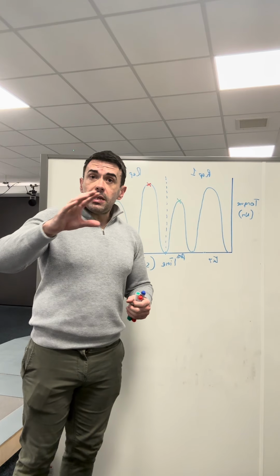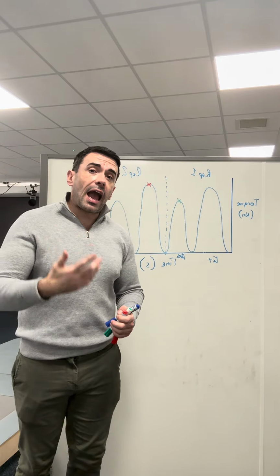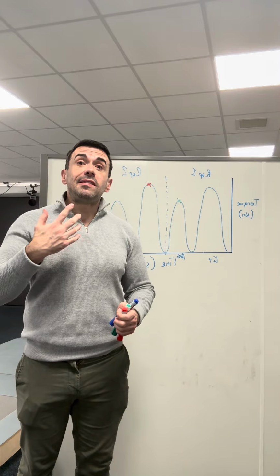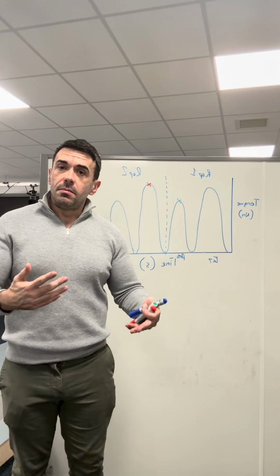So check peak torque, see if there's a deficit. Let's say you've got a deficit of 15%, then look at average peak torque and see if that deficit is still present, particularly when you're working at higher angular velocities and you're performing more repetitions.